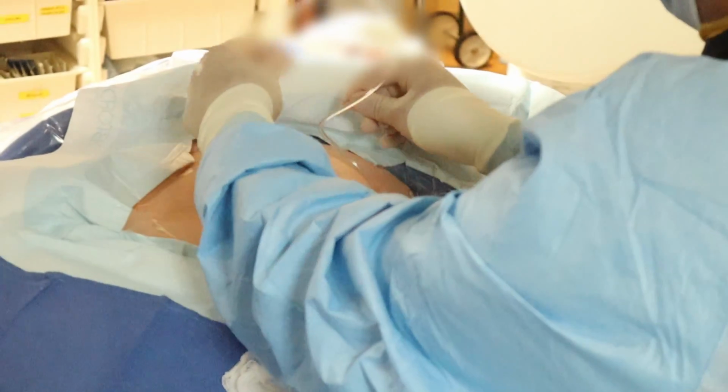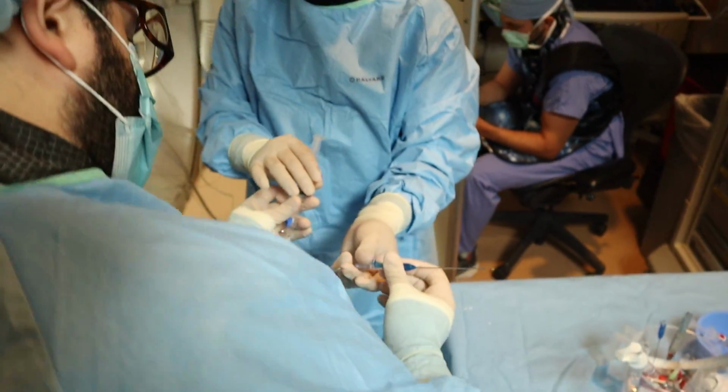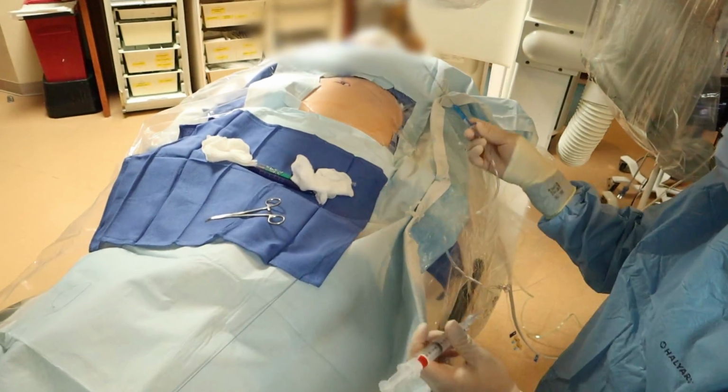Push this thing in. String off. Test this in the fluoro. We'll tack that. The kit comes with 4 T-tacks just in case one gets lost or something doesn't work out, but we'll do a total of 3.